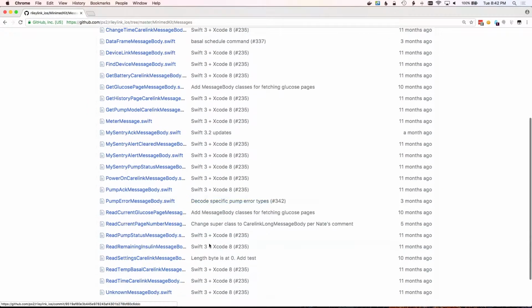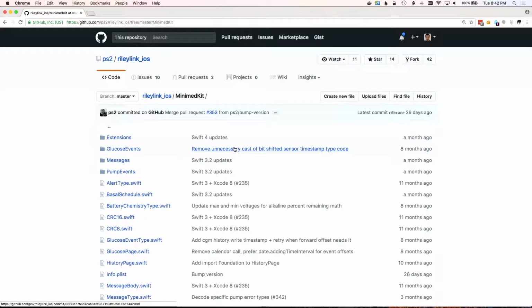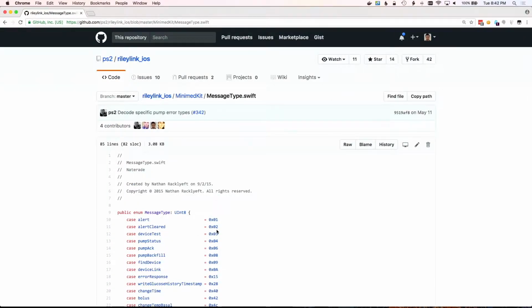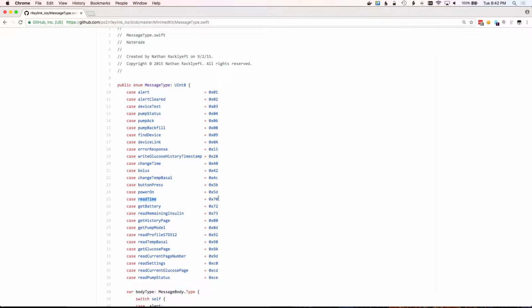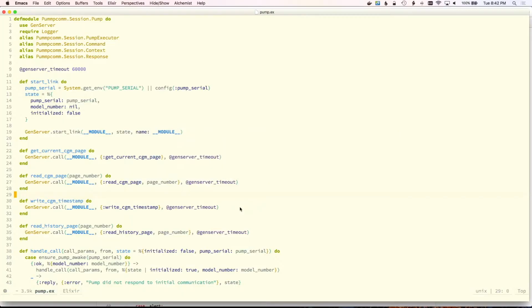So as I dig into the code here a little bit, I'm pretty familiar with this. I actually wrote the CGM implementation for the Swift side of things. So I've been around these files quite a bit, but I don't exactly remember where everything is. It's been a little while. In any event, this is the message types that you can send to the pump. And you can see there's a read time one. So byte 0x70 in hex is the read time command. So I'm kind of going to just play around a little bit here and see what happens.